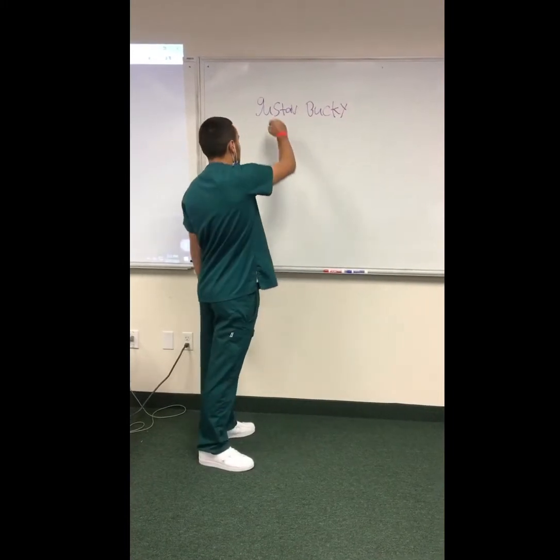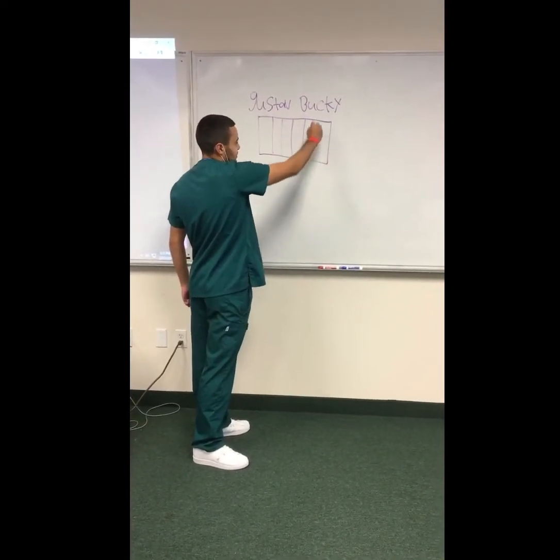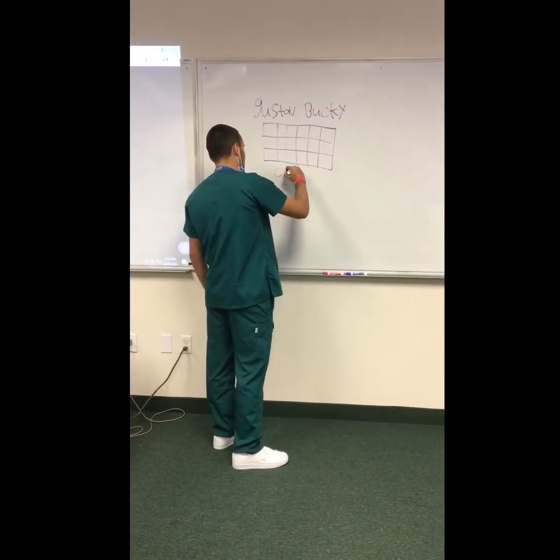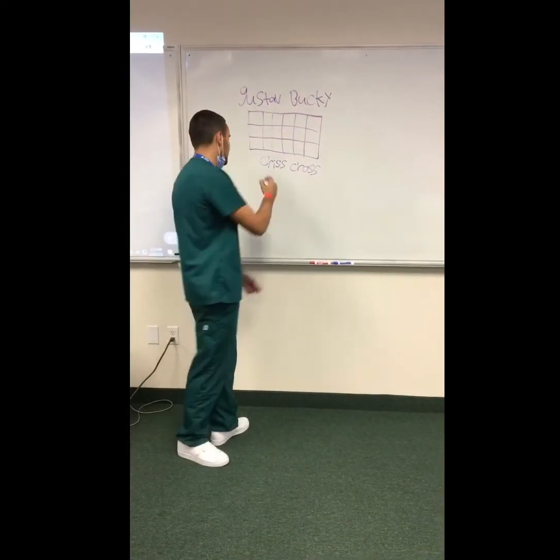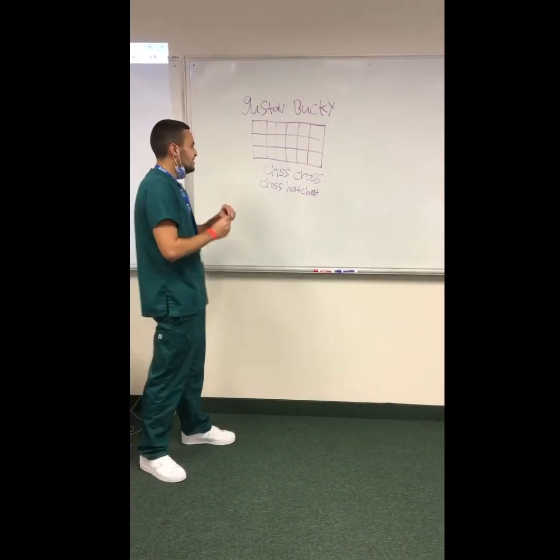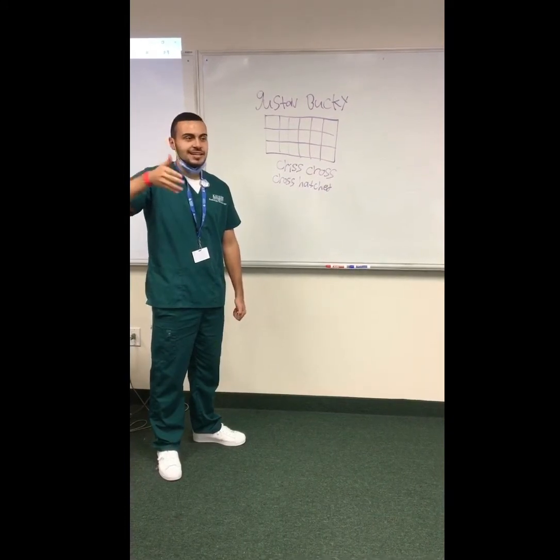So the first grid looked like this. It had the parallel lines, which are the lead strips, and grids use lead because it has a high atomic number, and they also had horizontal lines. This grid was also called a crisscross grid, or a crosshatched grid. Since this grid is not going to move, the lines are going to intercept with the image. So when the image comes out, you're going to see the lines in the actual image, kind of like a zebra stripe.